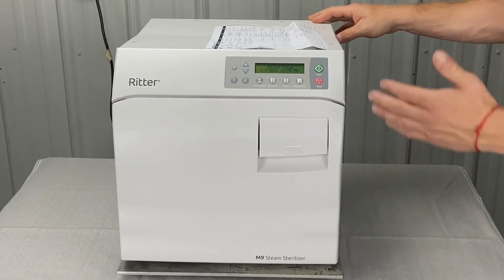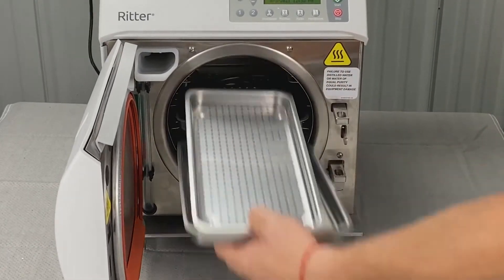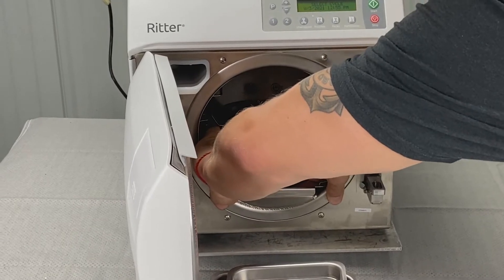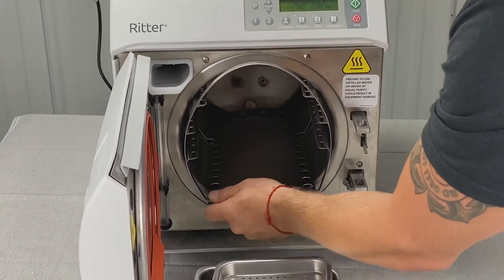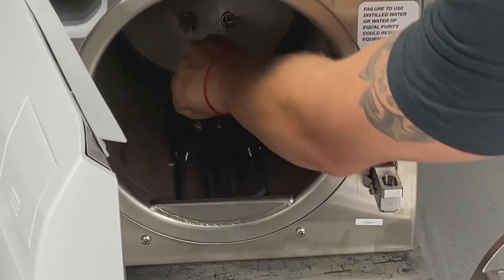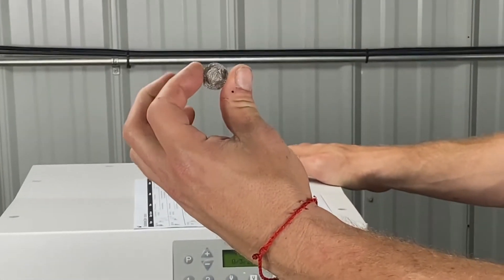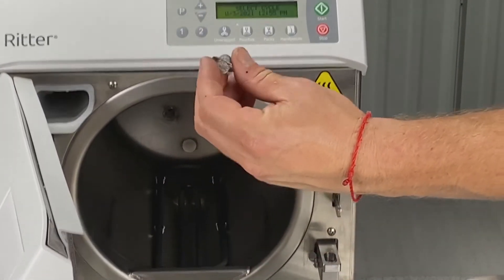If the problem persists, it could be that the chamber filter is clogged. Pull all the trays out — the chamber filter is part of your preventative maintenance, probably weekly. Here's the chamber filter. As part of your weekly or bi-weekly maintenance, take this chamber filter and make sure it's not clogged. Hold it up to the light, make sure you can see through it. Run some water over it, scrub it with a toothbrush, and reinsert.